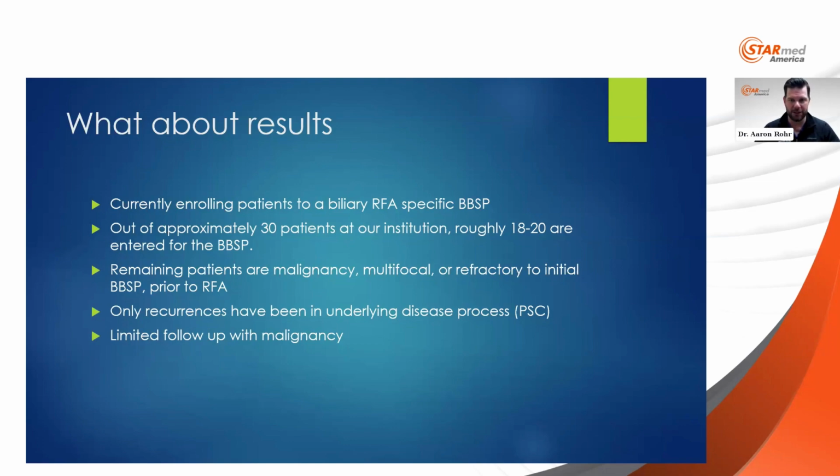So again, these are the underlying disease processes where you can imagine that just spot welding them as they show up is great, but they're in for the long haul. So a lot to be said whether or not that's going to be the answer for them versus a long-term drain. I don't have enough data to support that, but I will say that those have been the two that are one to two. One's mine, one's a partner's that we've seen.